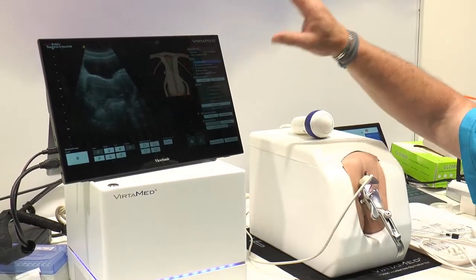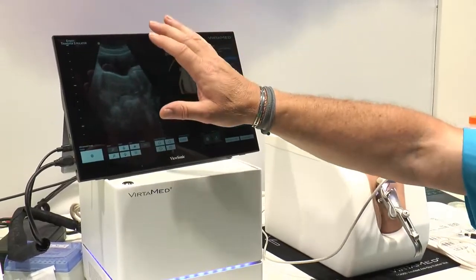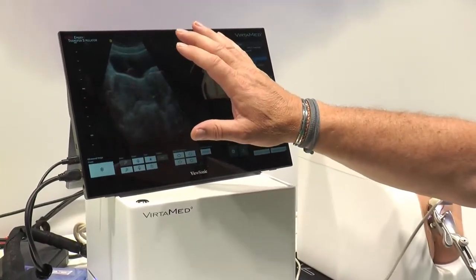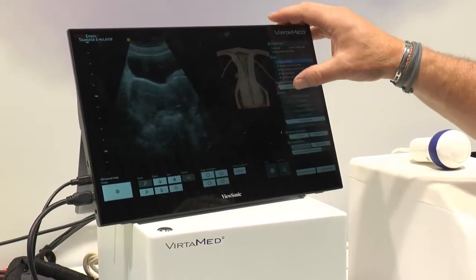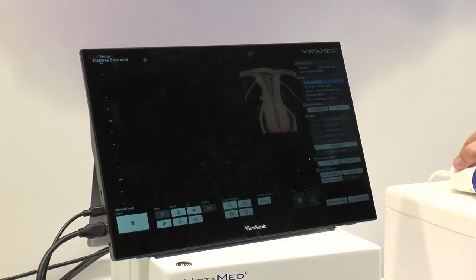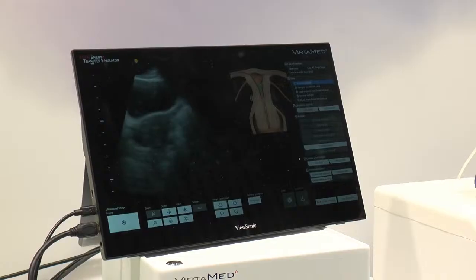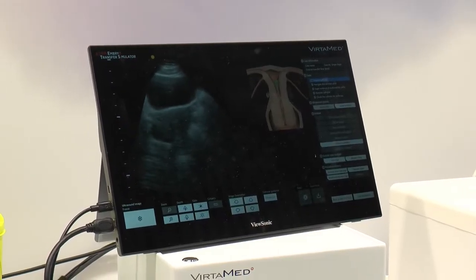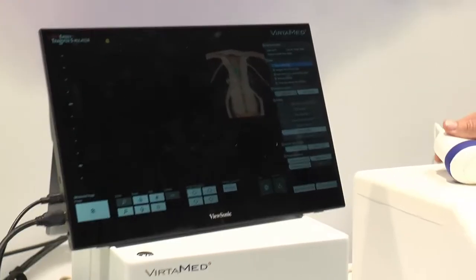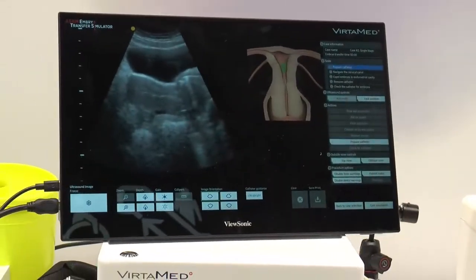So the simulator gives us some options of things that we can do. We've set it to have automatic ultrasound, okay? But if I'm teaching somebody else to do ultrasound to help me, we can actually use the scanner to do an ultrasound, okay? So in the first instance, that's usually quite difficult. And so we set it on automatic. It makes life easier for everybody when you're learning.